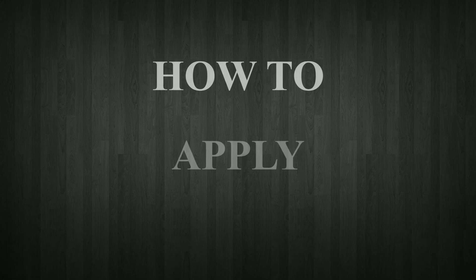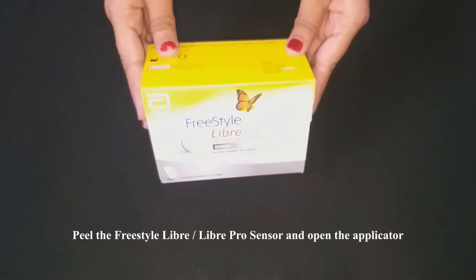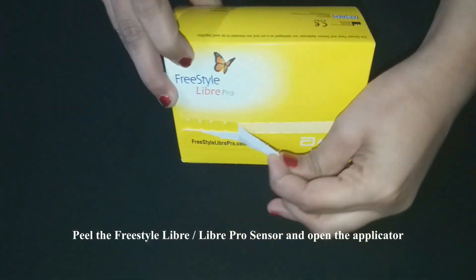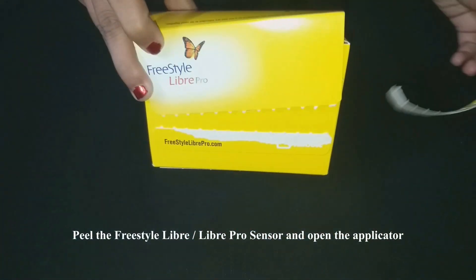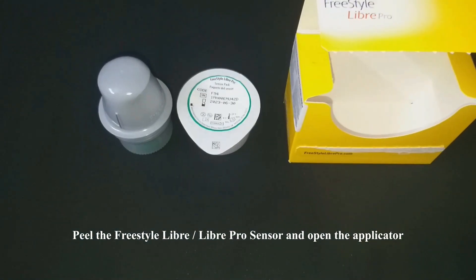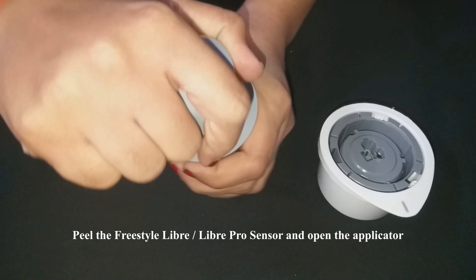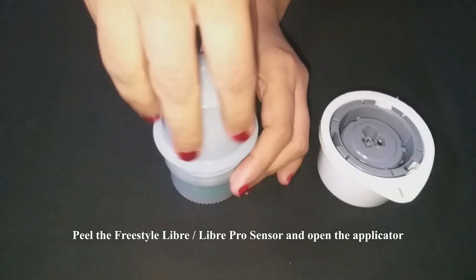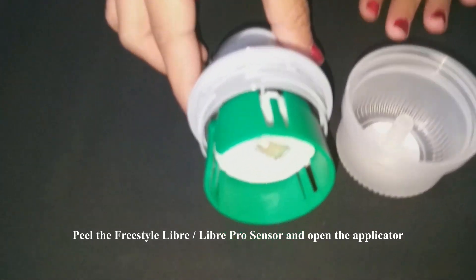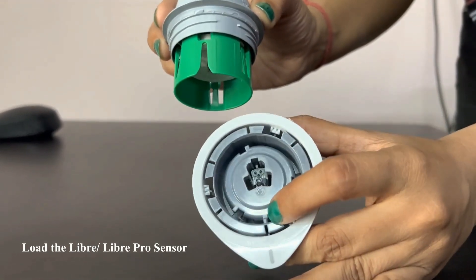How to apply Blucon Nitrider and activate Libre sensors. Peel the Freestyle Libre or Libre Pro sensor and open the applicator. Load the Libre or Libre Pro sensor.